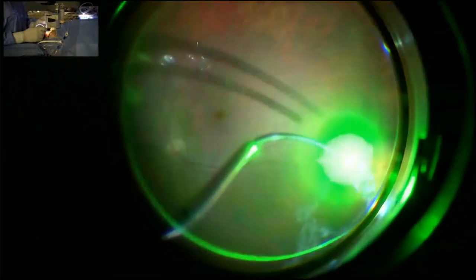But this is still a controversial point. In such a patient, we remove the vitreous, we clean the vitreous, we remove all traction. This means that there is no potential traction that may later create another new tear, and therefore it's better to do laser only around the retinal tear area.